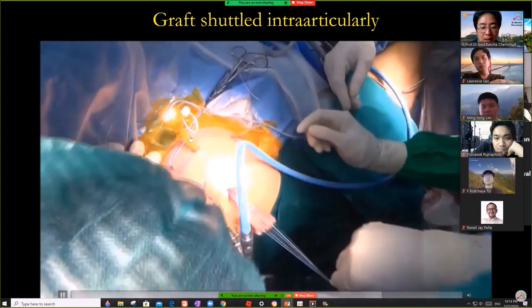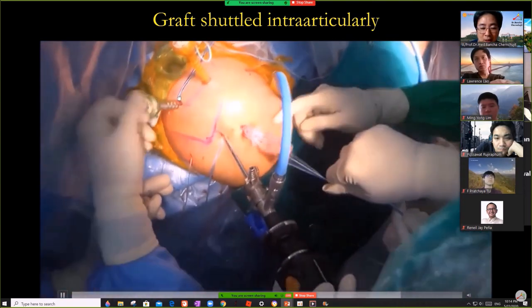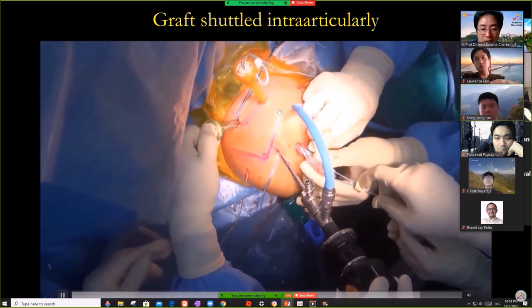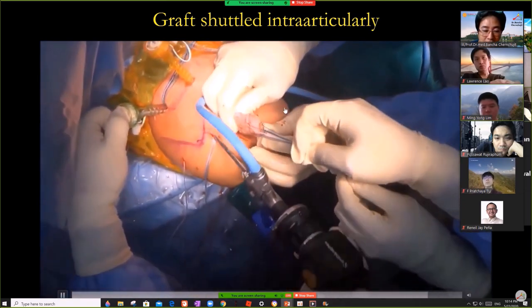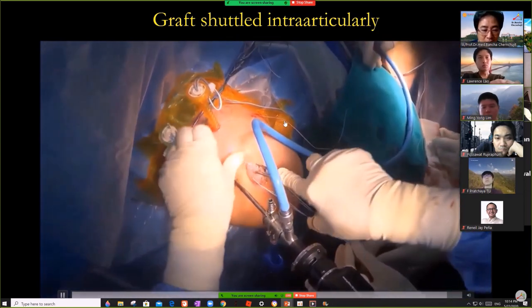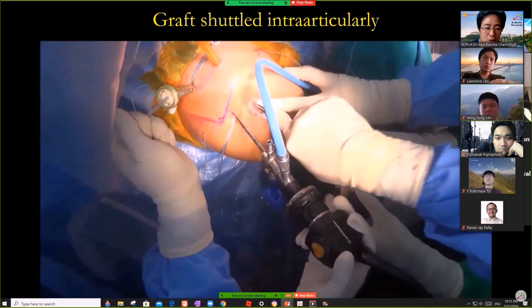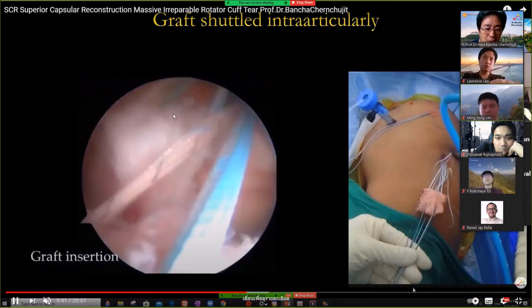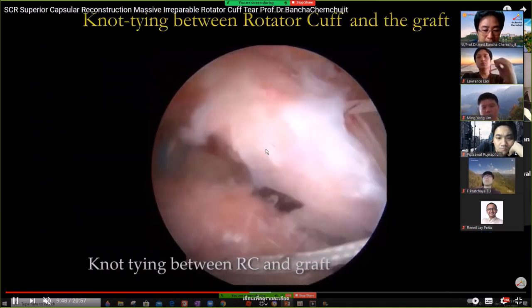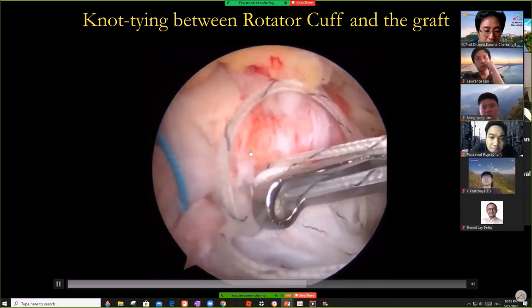This cup is big, you cannot use the suture hook to pass it through — not easy. This is the old fashion; now I change my technique and also pack the suture into the distal part. Then I split my cannula — this cannula is cut in the middle, you can split it. Then you pull the graft in and at the same time pull and push. The green suture on the Neviaser portal — you pull it up and push it in simultaneously. When it gets in you spread the graft using side-to-side repair, front and back.